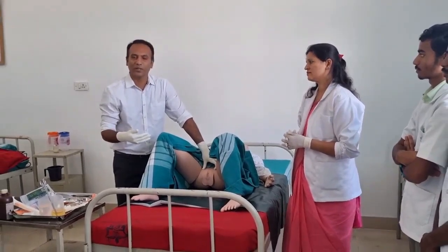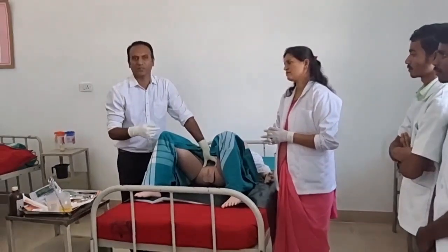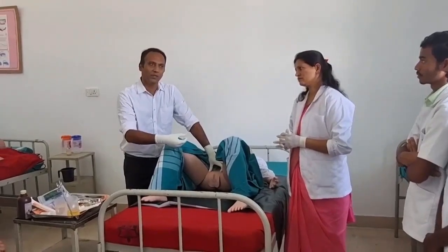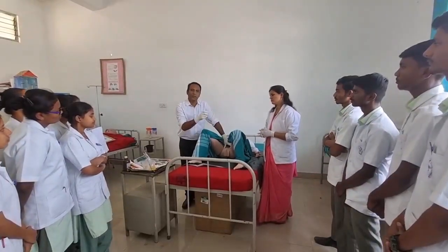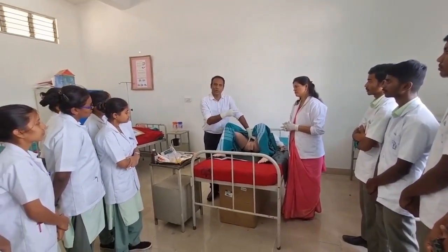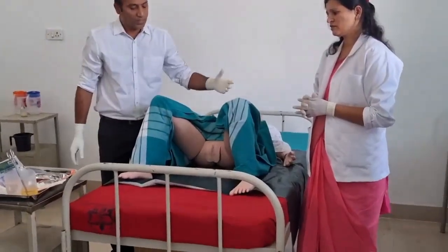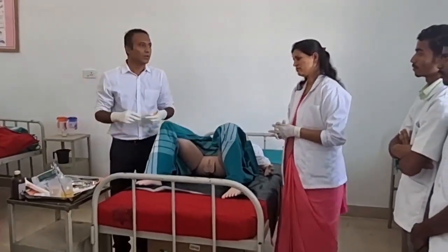Some people recommend pushing it in up to 5 to 7 centimeters, because after inflating the balloon we can slightly pull it back. Inside the bladder we have the internal sphincter, and up to that level the balloon will come and fit.